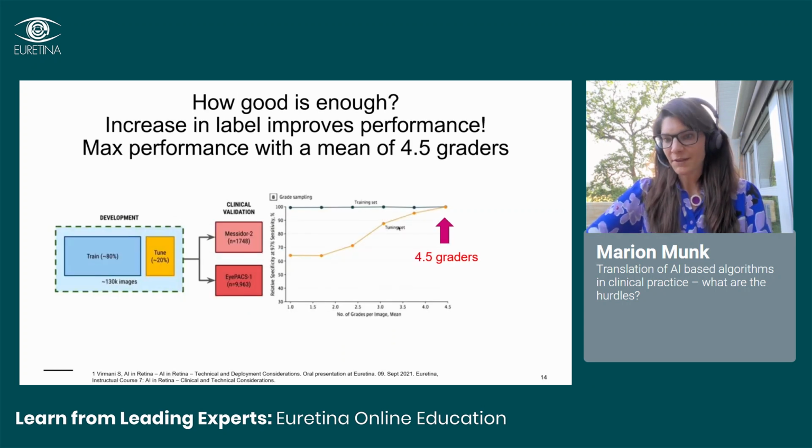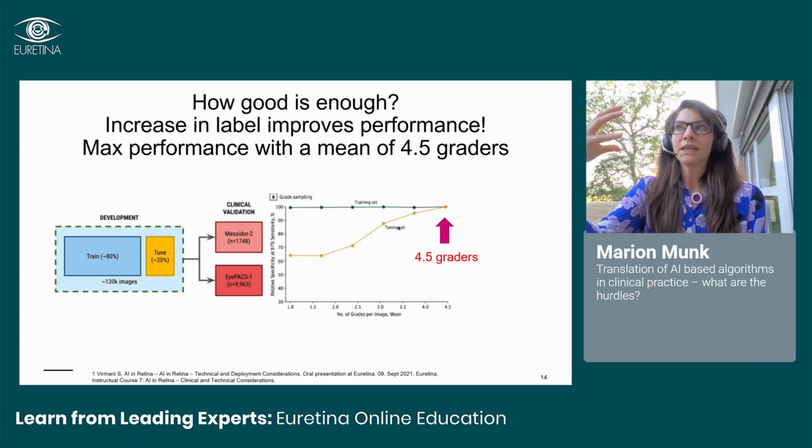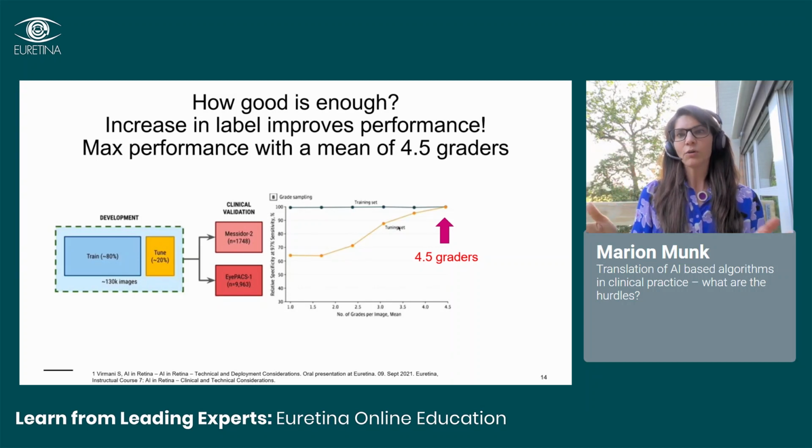What about the quality? Usually, the top quality can be reached. It does not mean that the data quality or the images have been perfectly fine. It rather means that the expert annotation is really accurate and good. The way you reach this is that you do not use only one grader or one expert who tells you that this is present or absent, but rather several graders.